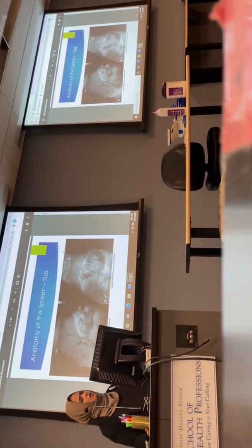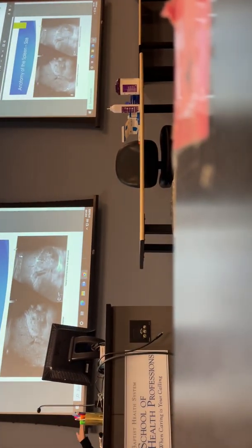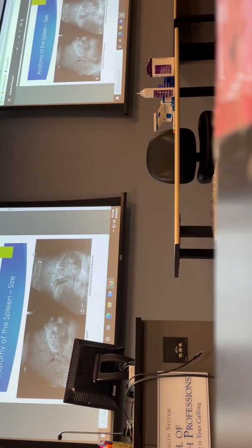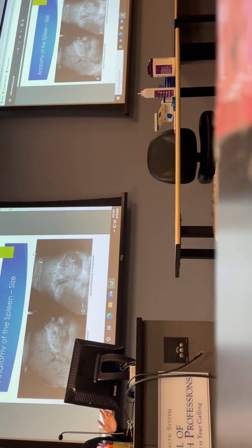At this point, you guys can all tell the difference between a sagittal and a transverse view. A lot of you have asked me to open up your imaging assignments, and I will. I'll open all of them up for abdomen and OB so you can review them, but don't only study those, okay? I'm not only going to give you the images in these assignments. There can be images outside of this, so just a heads up on that.